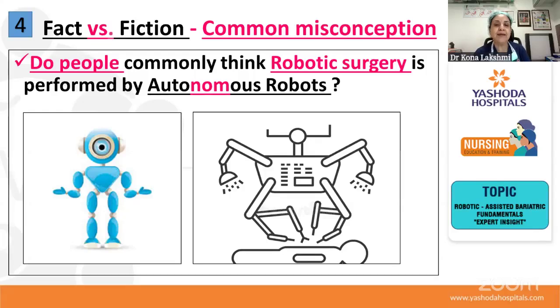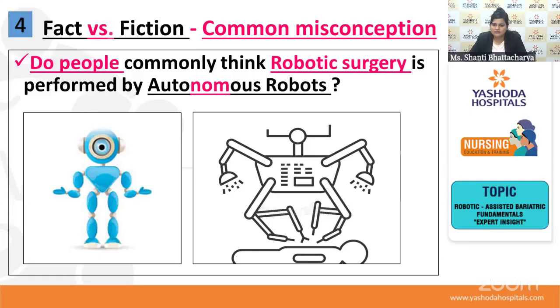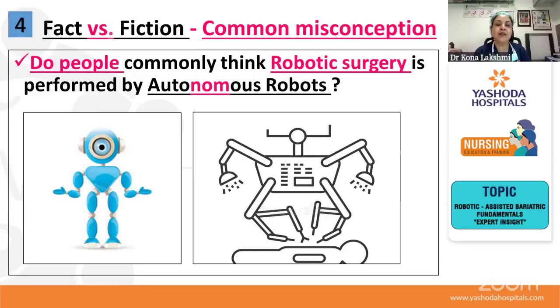So same in laparoscopy, when we are doing, I have to see how the person is holding the camera. Is my assistant holding properly? Are they clashing with my instruments? In robo, it is not like that. It is one single platform, like your first nurse said, all the instruments are attached to one platform and then you do the surgery.